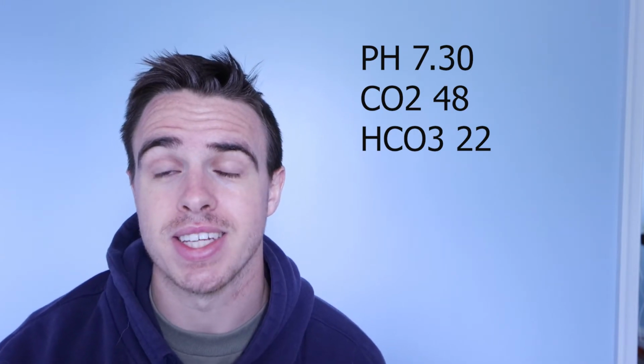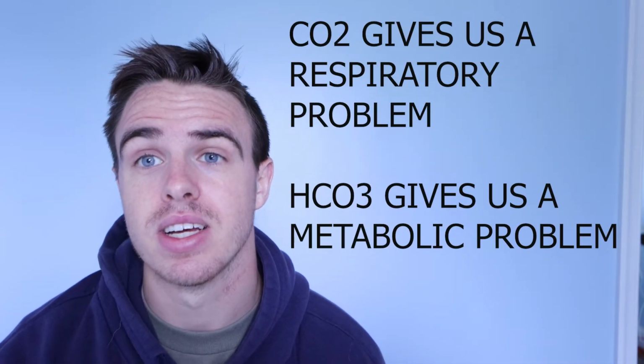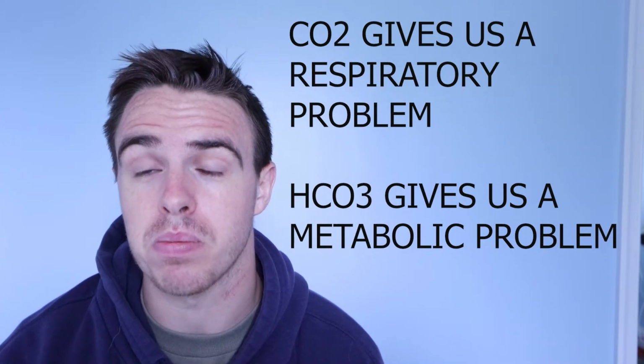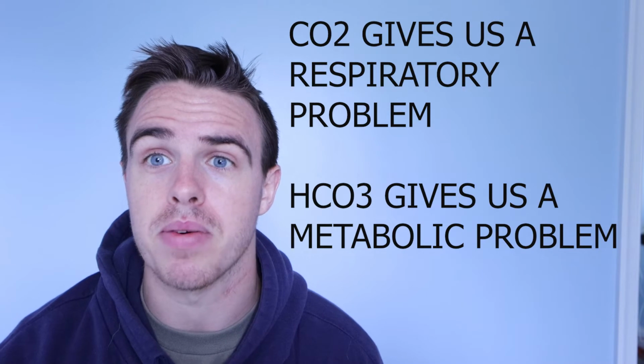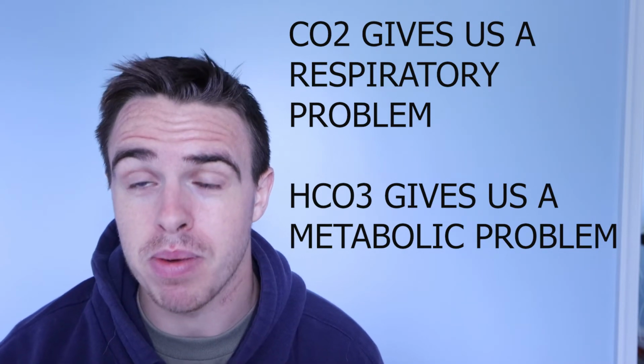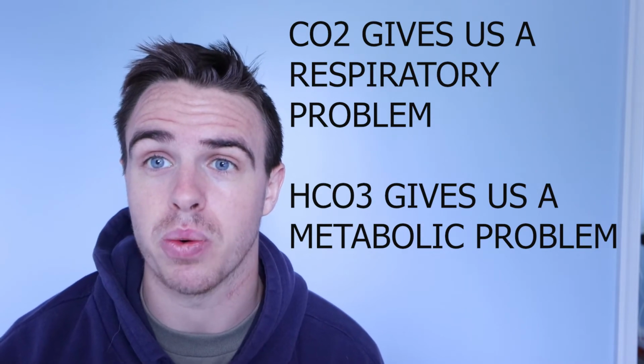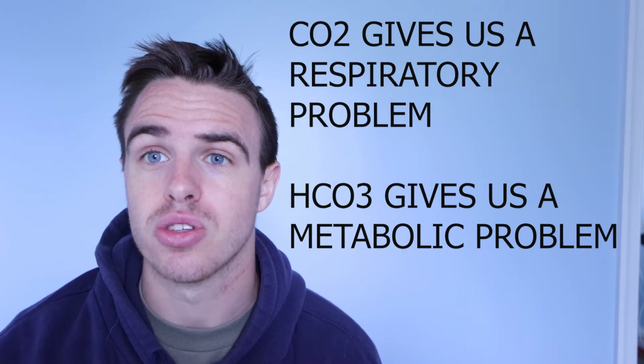So I think this is the perfect time to talk about this. We can see that our pH is out of whack, and our CO2 is out of whack. CO2 is respiratory and the bicarb is metabolic. Therefore, if the CO2 is out of whack, that means we have a respiratory problem. If the bicarb is out of whack, we have a metabolic problem. I want you to remember those terms exactly. CO2, respiratory. Bicarb, metabolic. So we look at this one again. CO2 is out of whack, so therefore it's a respiratory problem.